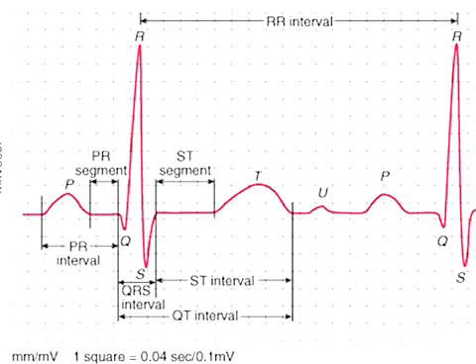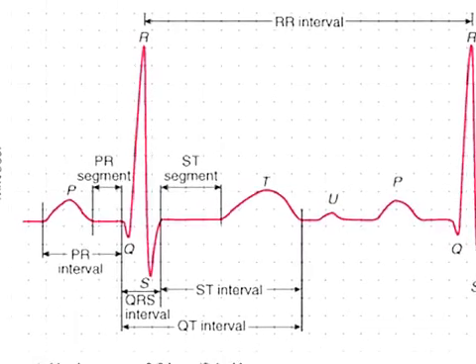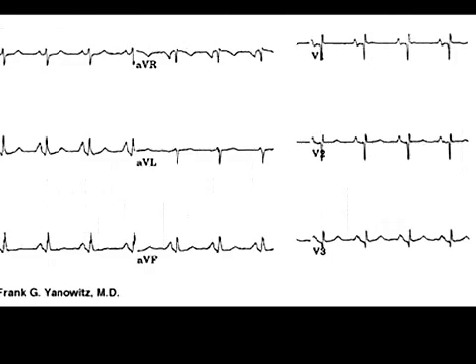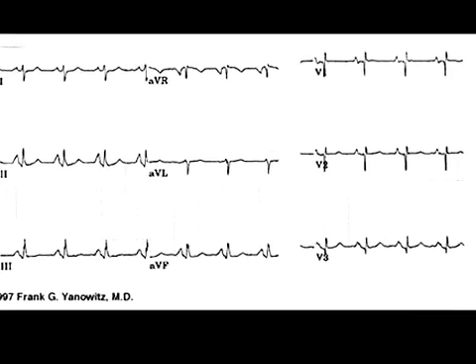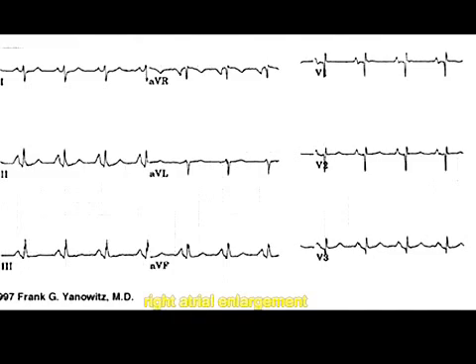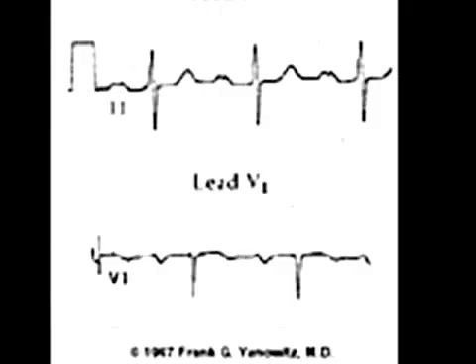Now let us review some of the most important EKGs. Here you can see a big P wave. This is very common in right atrial enlargement — because the atria is big, the P wave will be big. In left atrial enlargement, you can see a notched P wave or M-shaped P wave, as seen here. This is characteristic of left atrial enlargement.